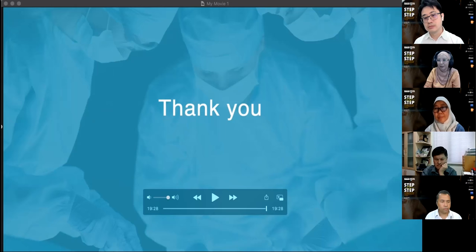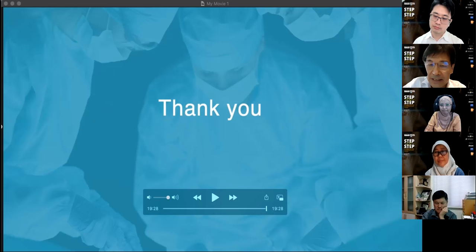But I agree with Dr. Chung, the Kowa lens is very, very nice to use. I must say that. Can I ask Dr. Chung two questions actually? One, your slit technique of anchoring the lens, you don't need glue, isn't it? Yes. That's a very good technique because glue is so expensive. I don't have to use glue.